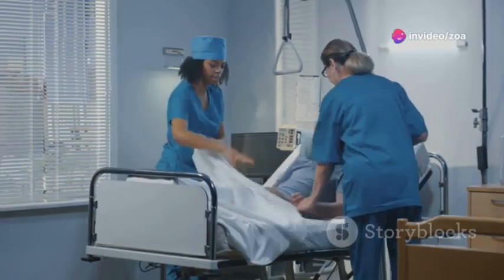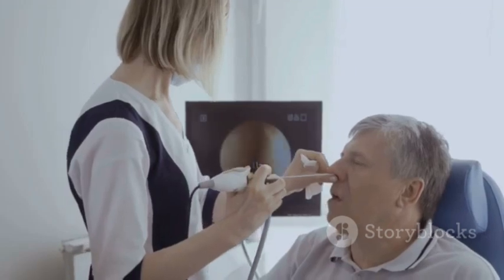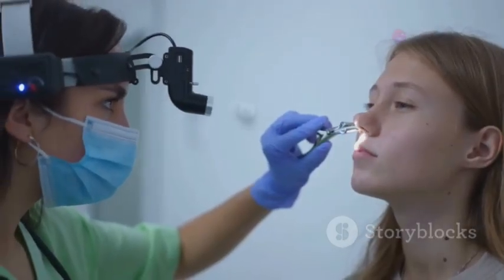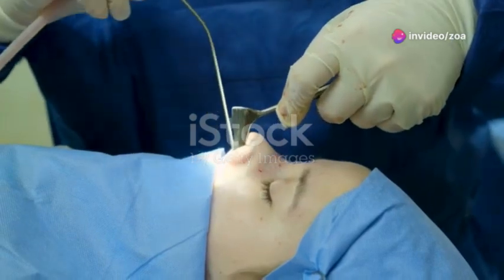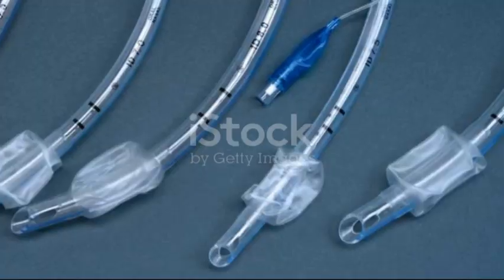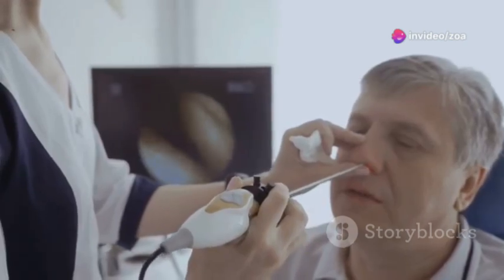Prepare the patient. Position them supine with their head in a neutral position. Inspect both nostrils for patency and choose the larger one. Apply a topical vasoconstrictor and anesthetic to the chosen nostril to minimize bleeding and discomfort. Lubricate the ETT generously and insert it into the chosen nostril, advancing it gently along the floor of the nasal cavity. If resistance is encountered, rotate the tube gently or try the other nostril.